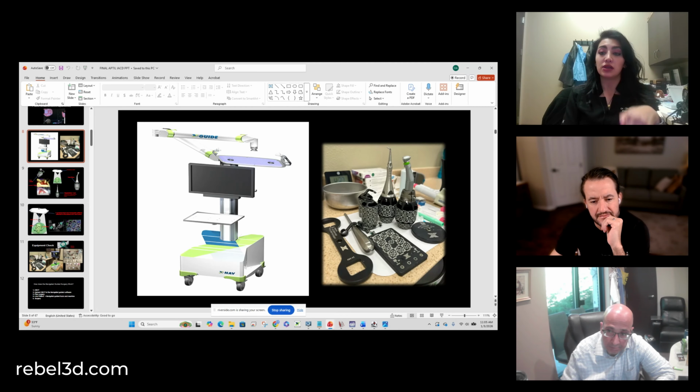Now, if the patient is edentulous, then we are using metal pins, which we call X-Mark pins. We place them way in advance of surgery day. We have them ready, we take our CT scan with them, and we do our planning based on that CT scan. So this registration tool helps you register whether it's teeth or X-Mark pins. And this is the tracker that gets attached to the patient's mouth.